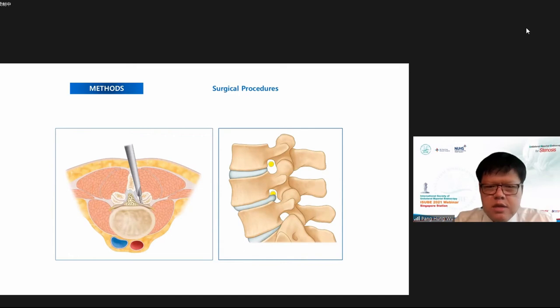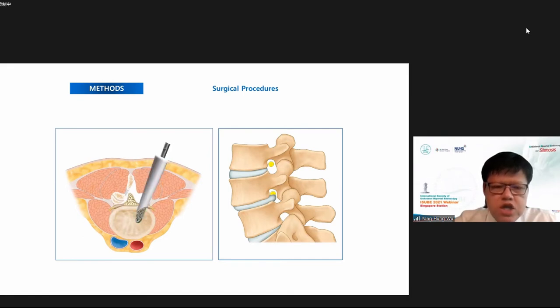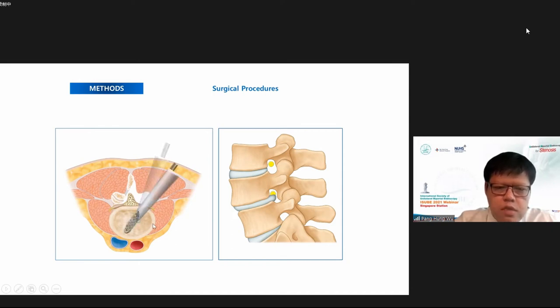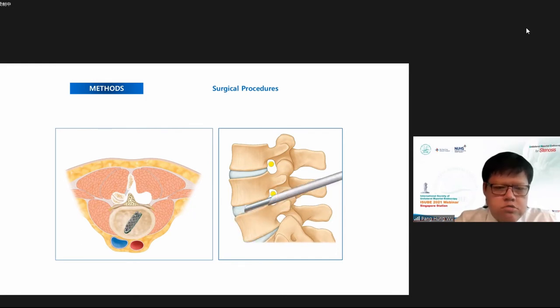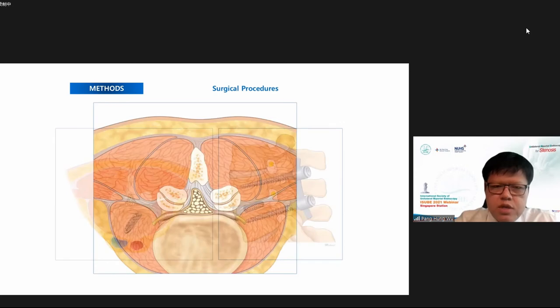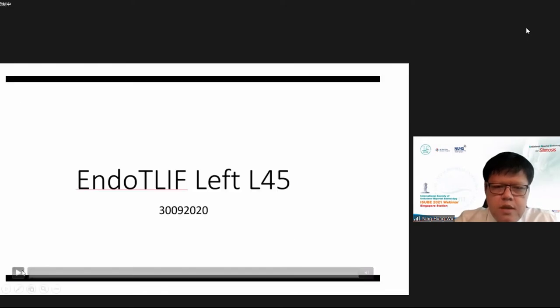In biportal fusion, we use similar strategies. Instead of a uniportal tube to protect the traversing nerve root, we use a specialized retractor and an assistant holding the nerve roots, freeing our hand to insert the cage. We tend to place a large bullet-shaped cage used in microscopic tubular fusion surgery, and then insert the screws.